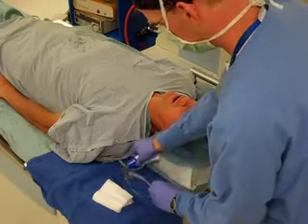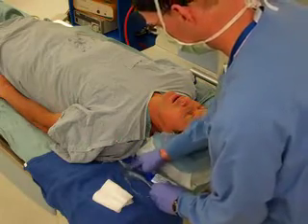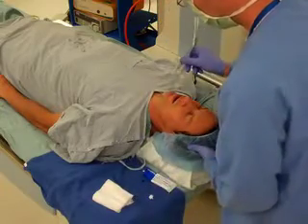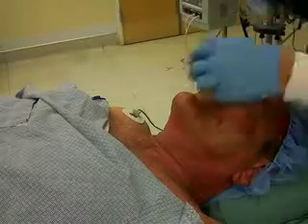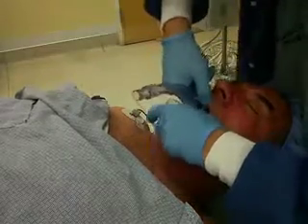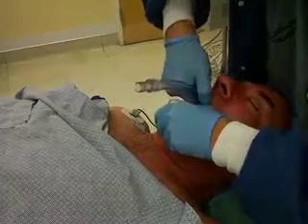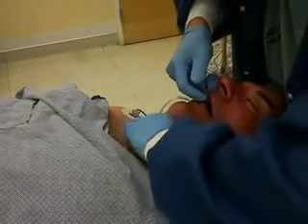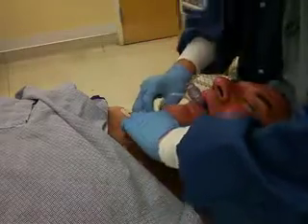Additional lubrication or briefly dipping the cuff in clean water may also help prevent the cuff from sticking to the tongue and oropharynx. In addition, a small mouth opening or large tongue may prevent use of the operator's finger and hand to get the laryngeal mask airway behind the tongue. In such cases, use of the connecting tube shaft to create downward pressure may be necessary.